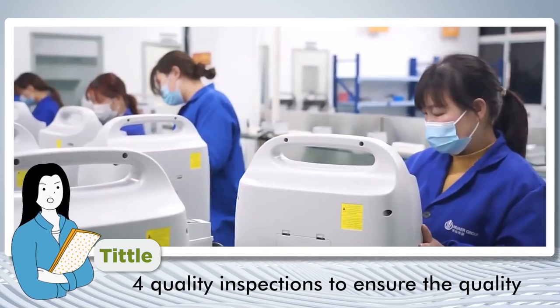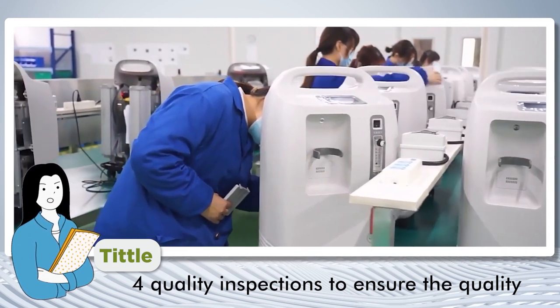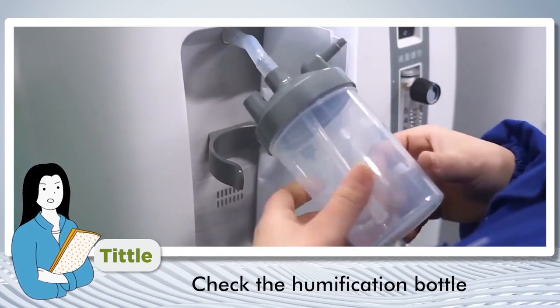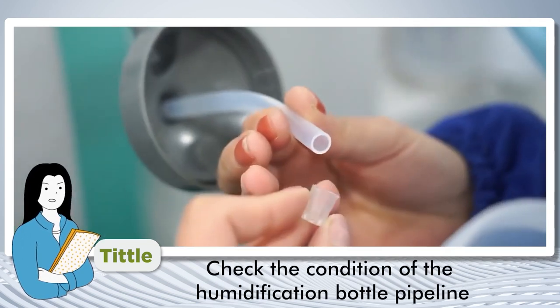We also have at least four quality inspections to ensure the quality of the oxygen concentrator. We check the humidifier bottle, check the flow meter adjustment, and check the condition of the humidifier bottle pipeline.